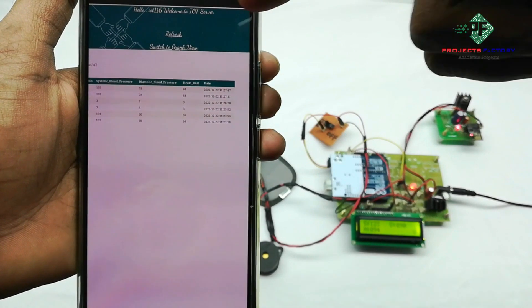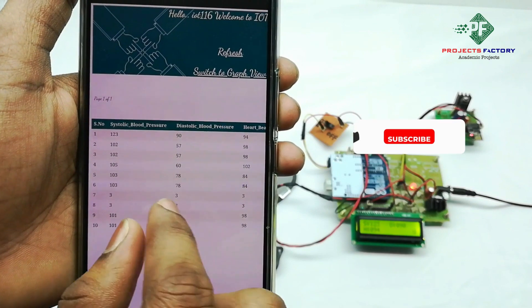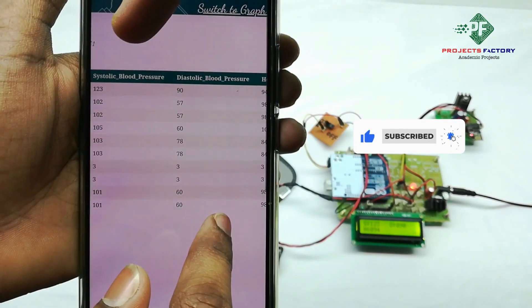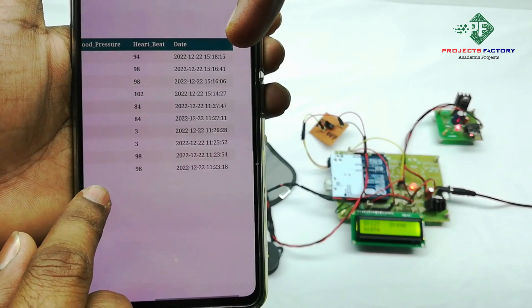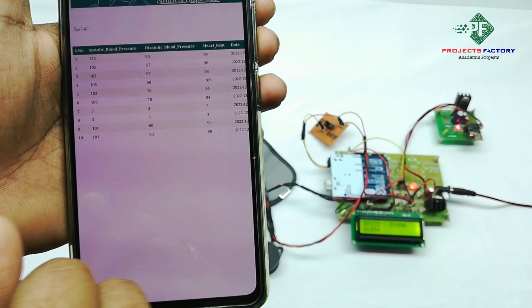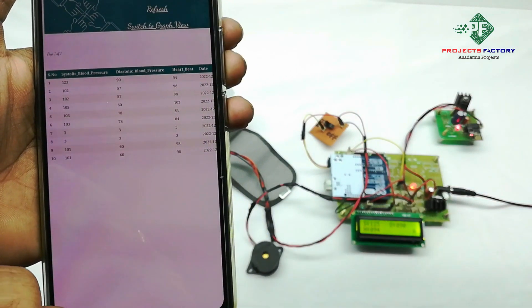We refresh this page. You can see systolic blood pressure, diastolic blood pressure, and heart beat with respect to date and time. If you want to see the graph view, press 'Switch to graph view'.